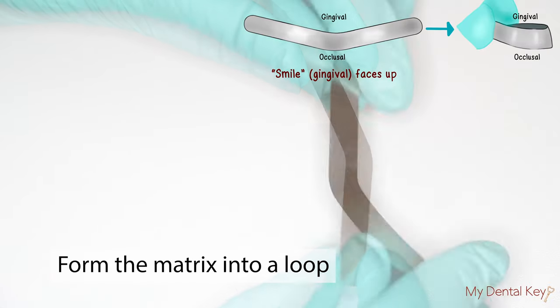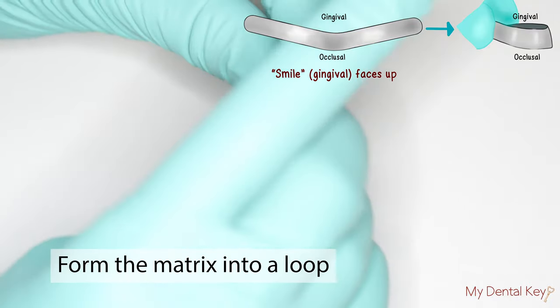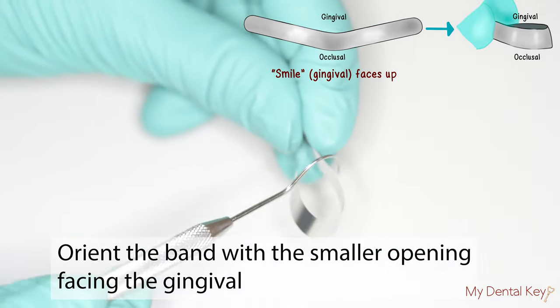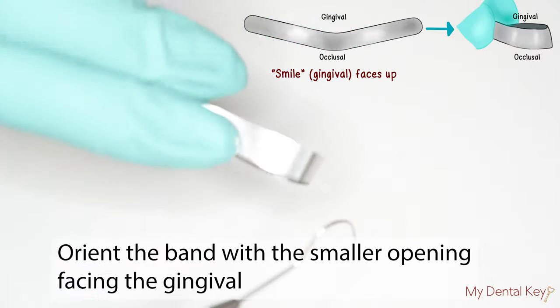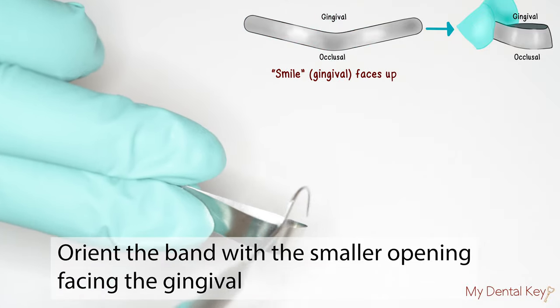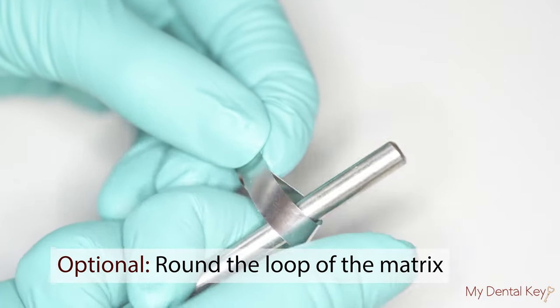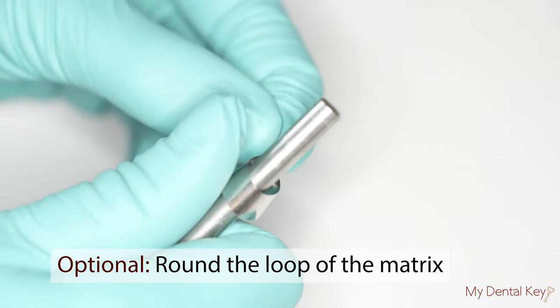Fold the matrix loop such that you bring the two ends of the matrix band together. Orient the band such that the smaller opening is facing the gingiva. The larger circumference opening is the occlusal portion. Optionally, you may also round the loop of the matrix using a round or cylindrical hand instrument.